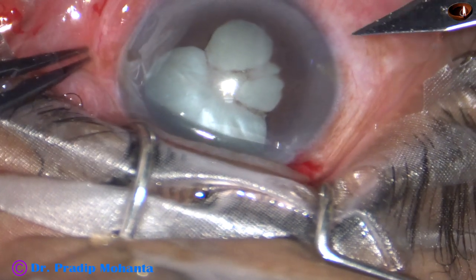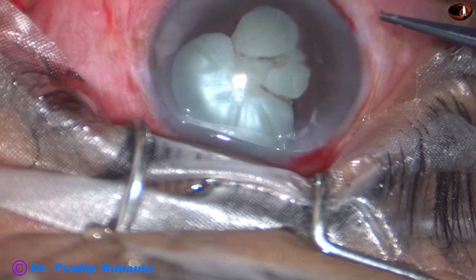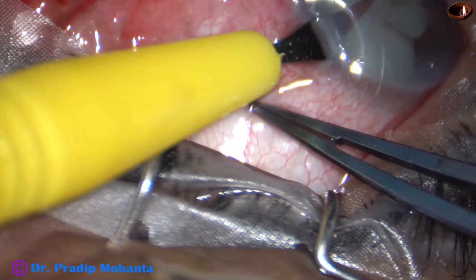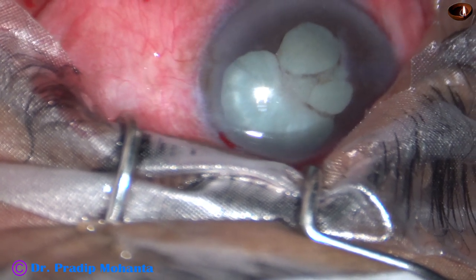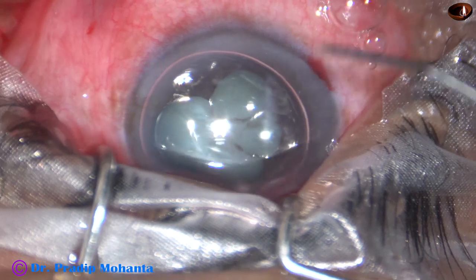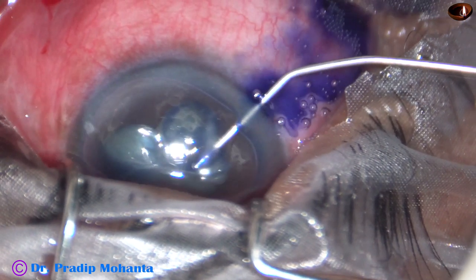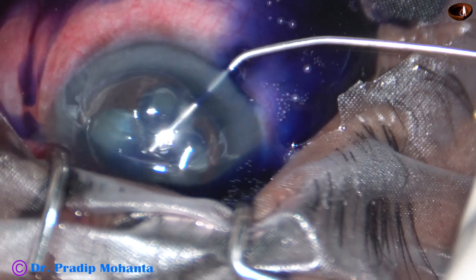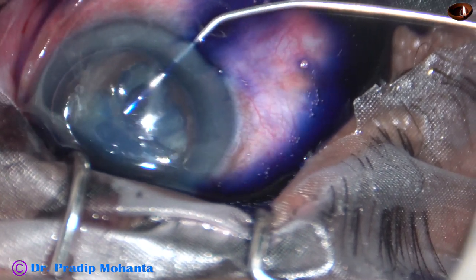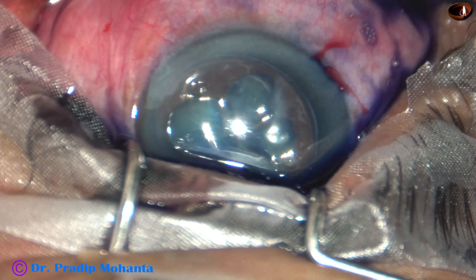Now I take a lance-tip knife and make a side port at 8 o'clock on the right side of the main incision, and another side port at around 2 o'clock on the left side of the main incision. My plan is to stain the anterior capsule nicely. Here goes an air bubble. Beneath this air bubble, I apply 0.06% trypan blue dye over the anterior capsule and the exposed cortex. In this case, the anterior capsule is torn from 11 o'clock to 6 o'clock.